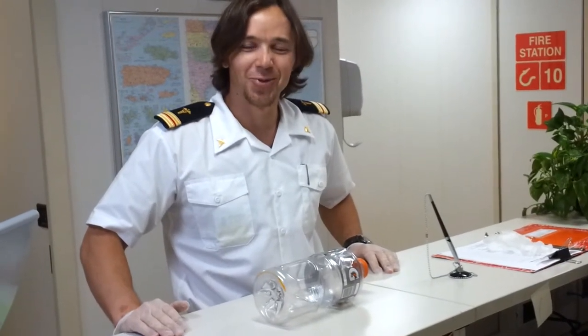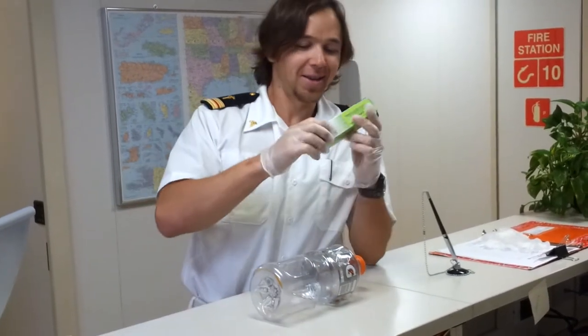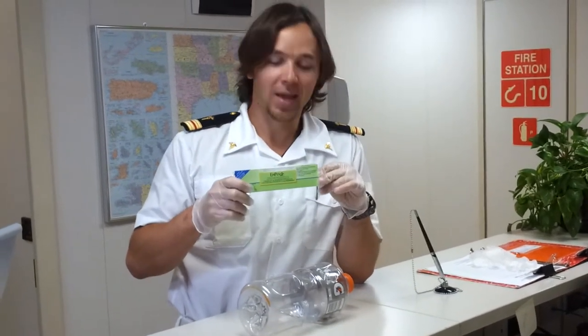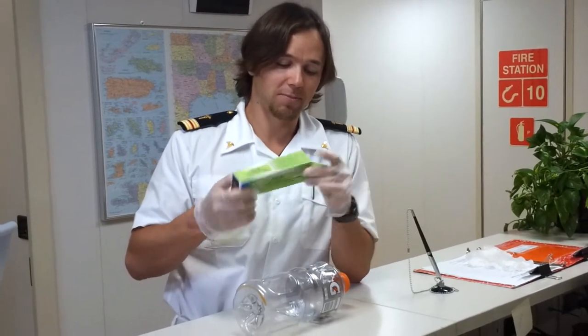Good evening guys. Today we're going to do a presentation on EpiPen. EpiPen is the epinephrine syringe used for self-administration. Just to give you an idea of how this pen actually works.